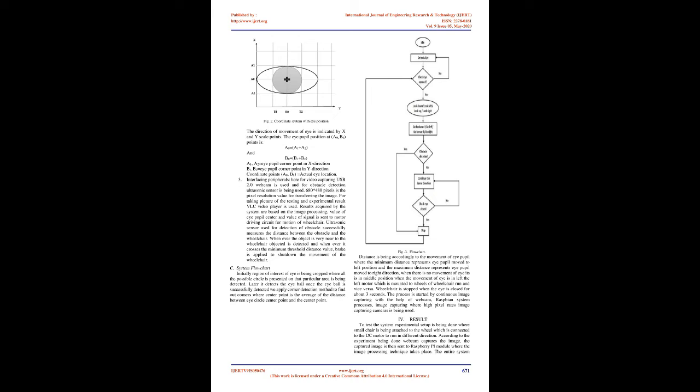Various steps are involved in implementing the project, and they are listed below. 1. Raspberry Pi operating system installation. First, the operating system is copied to a micro SD card, which is later placed inside the Raspberry Pi. The Raspbian image file is written using Win32 Disk Imager software. By placing the memory card inside the Raspberry Pi board, it can access the Raspbian operating system directly without any extra installation.